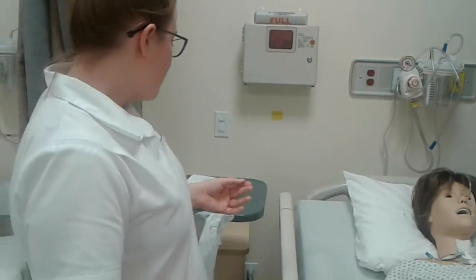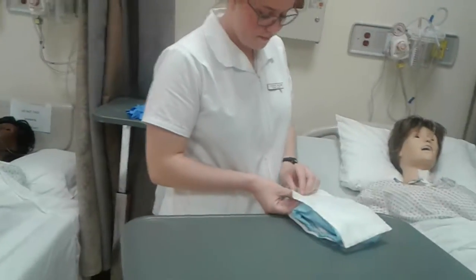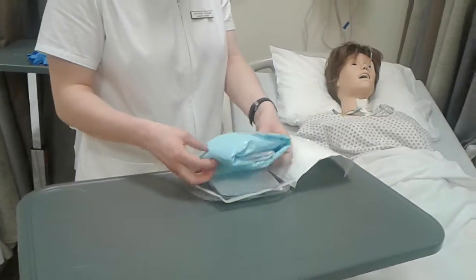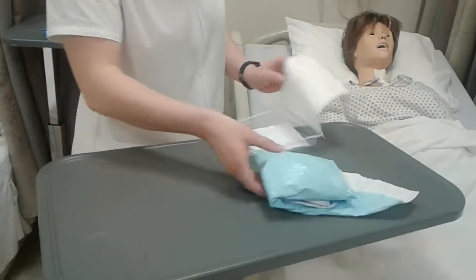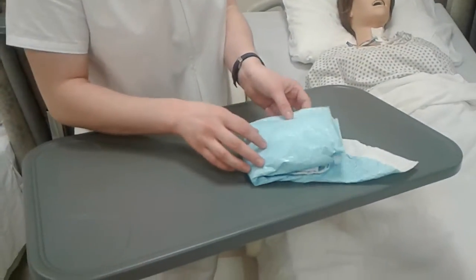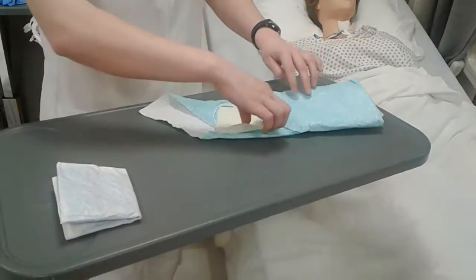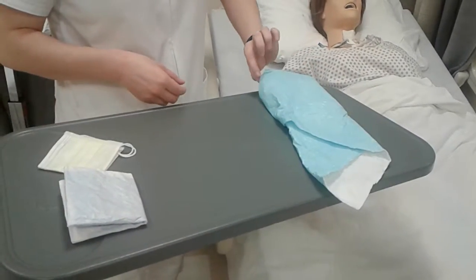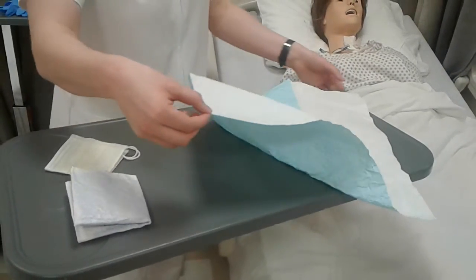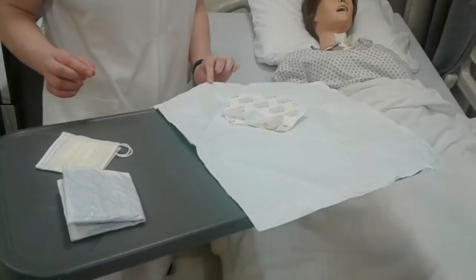So now to begin, I would open my central line kit. I'm going to throw this away. And I want to carefully open my kit. I have my sterile gloves and my mask. And while opening the kit, I want to stay within my 1-inch border to maintain sterility.